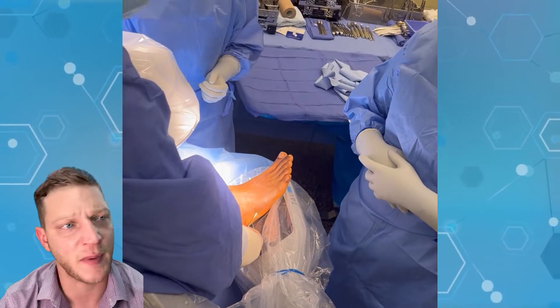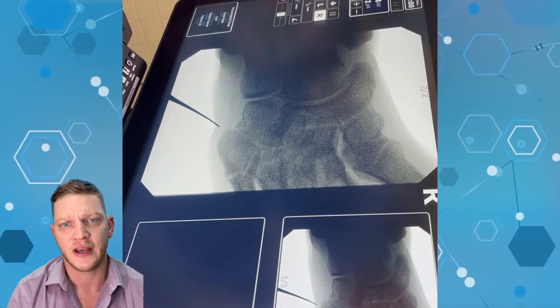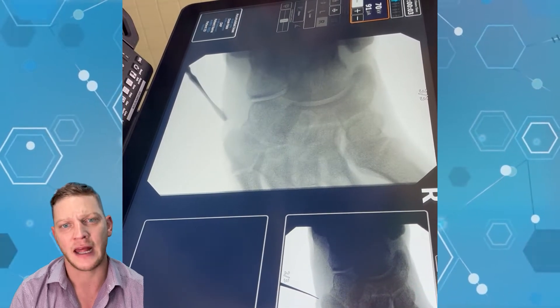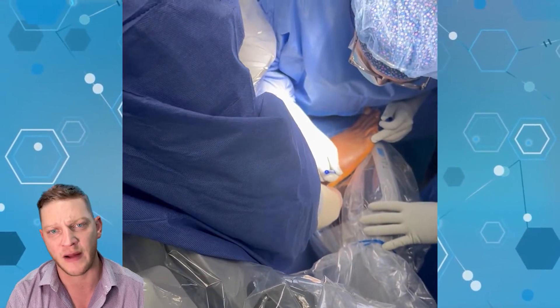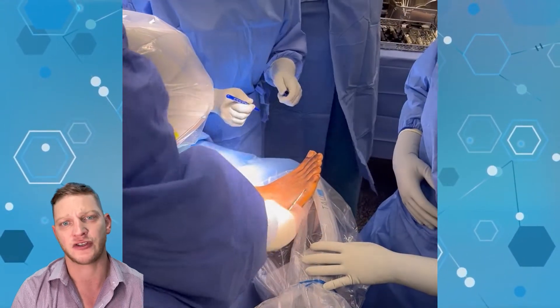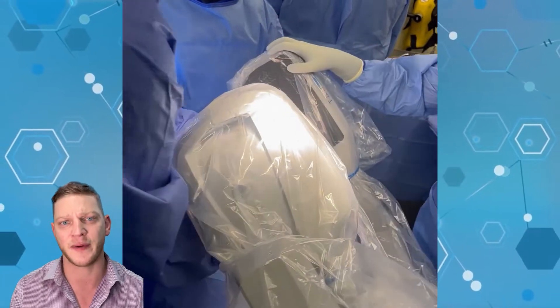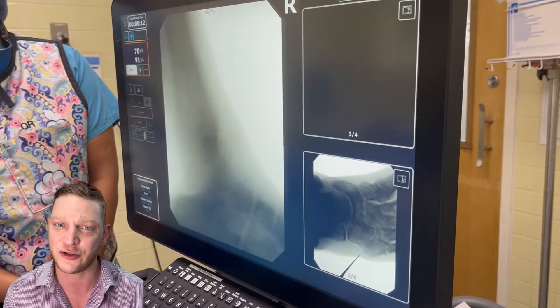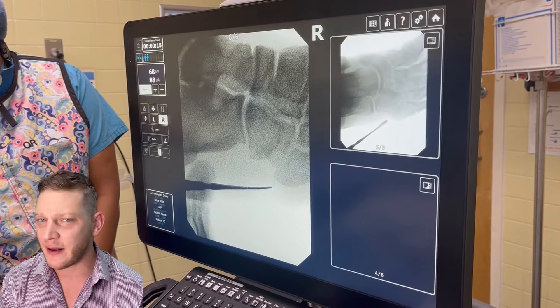Here's the incision. Once we found our spot we make the incision. The consensus for Jones fractures is that you use a very solid screw so there's less flexion at the fracture site. Any flexion can lead to a non-union. Jones fractures, because of the poor blood supply, any motion can lead to non-union — and those are complicated because then you have to open it up, scrape everything out, and reapply internal fixation. This can be a very long process, so whenever anybody tells you that you have a Jones fracture and may need surgery, they're not kidding.